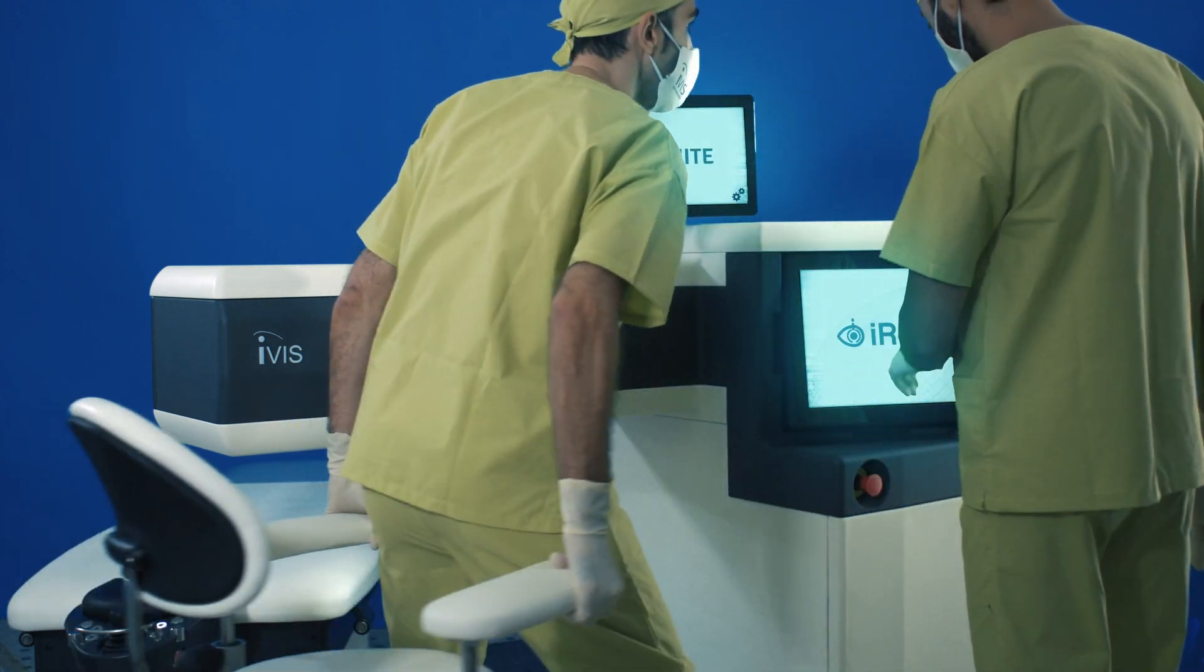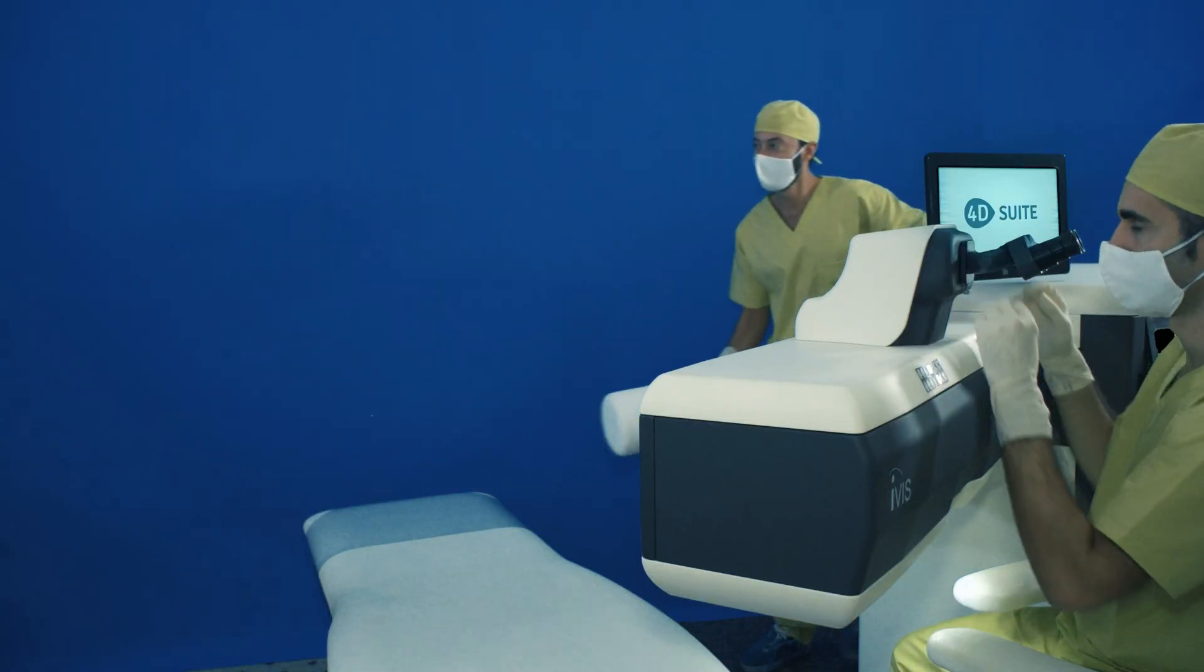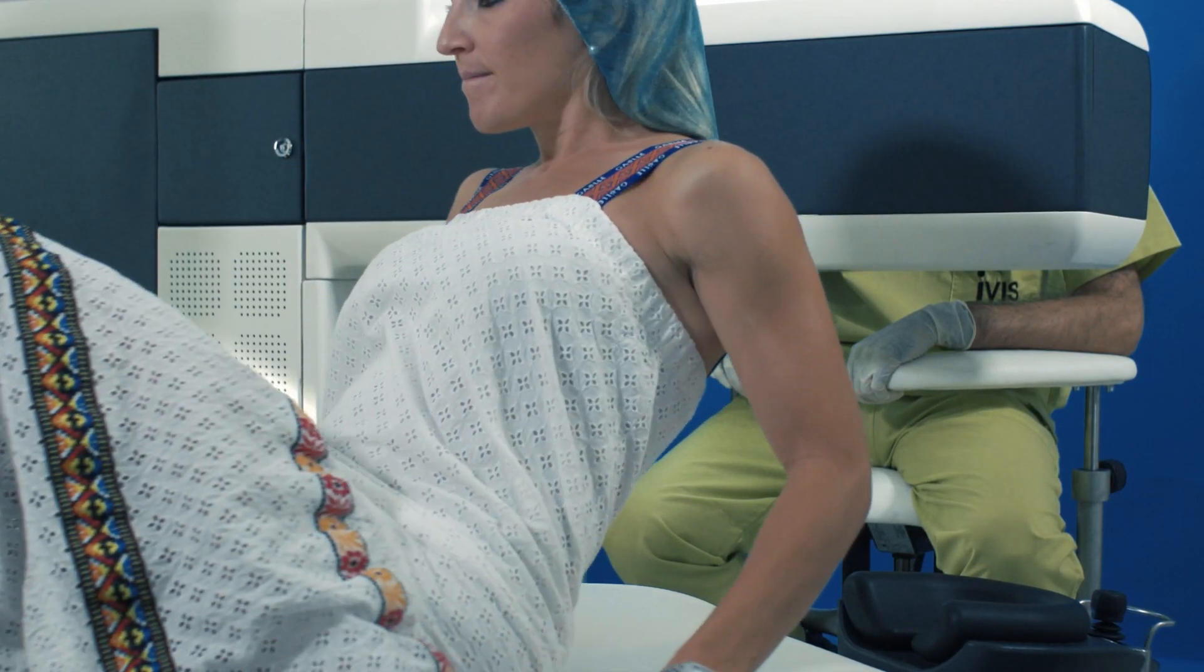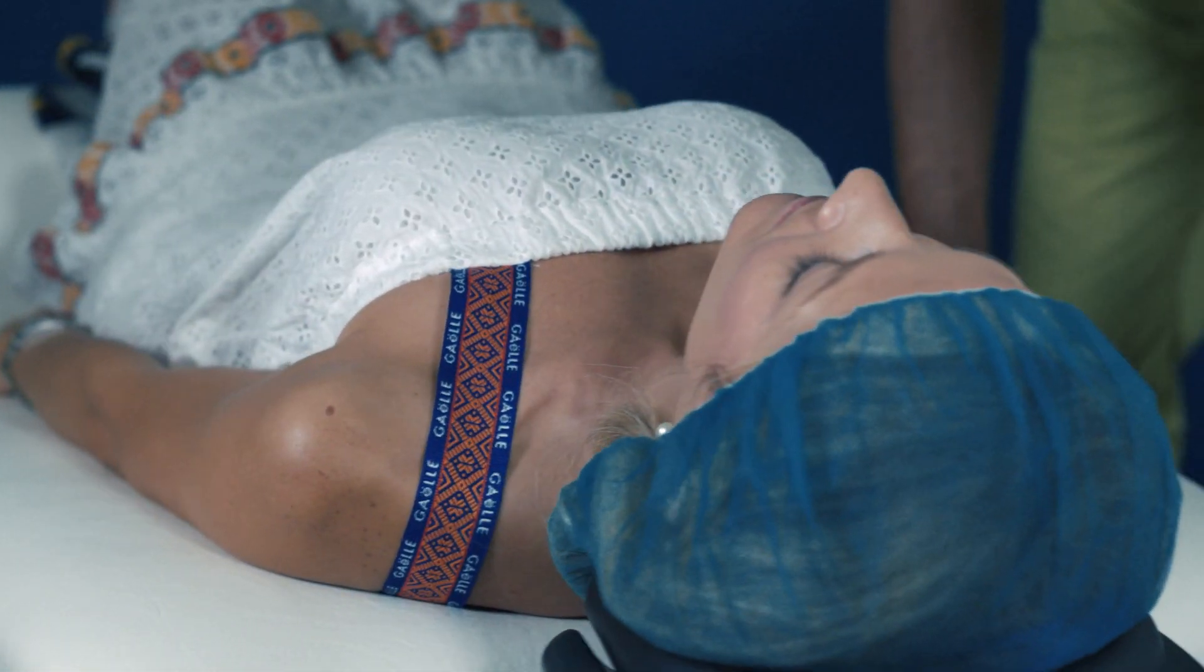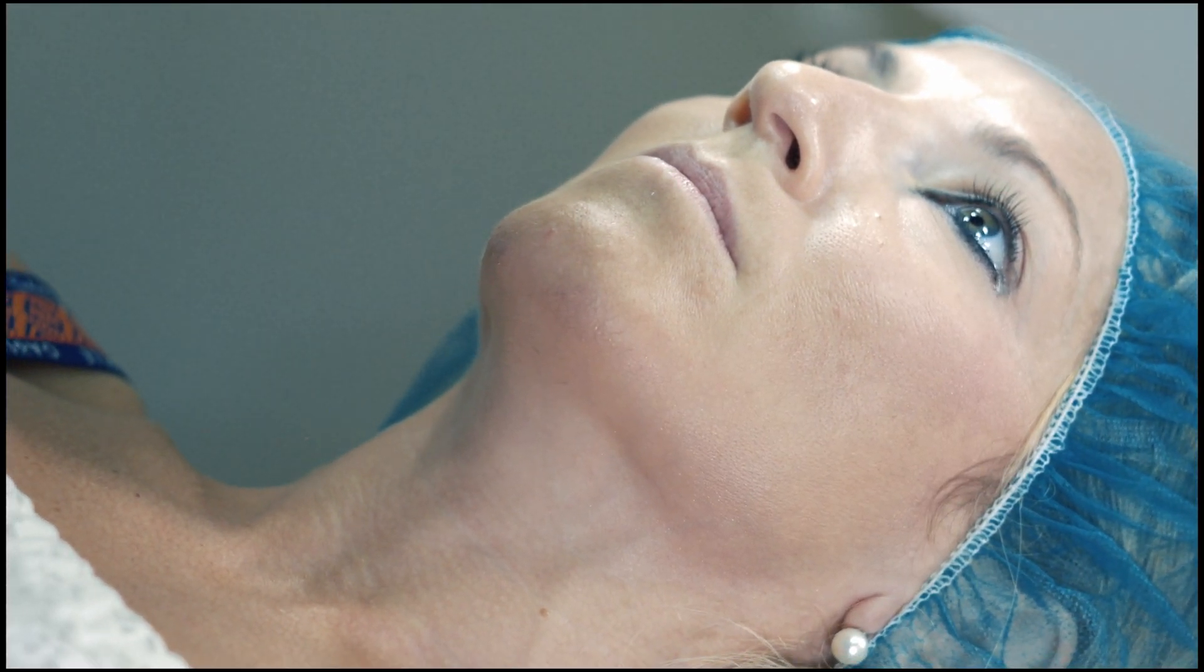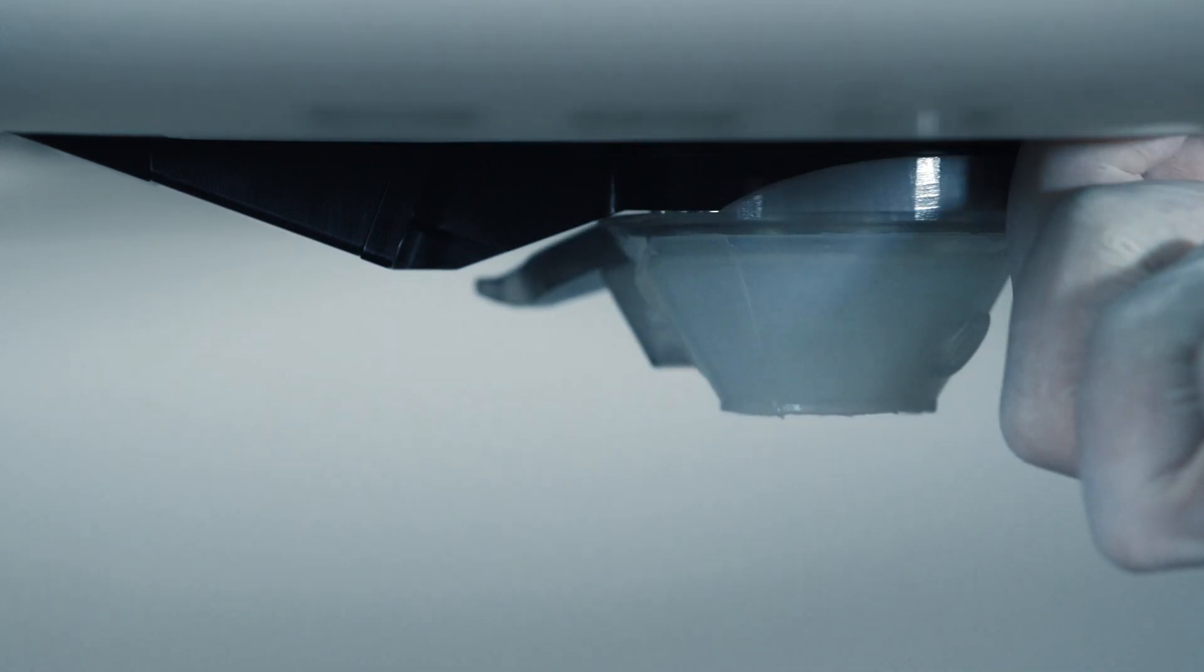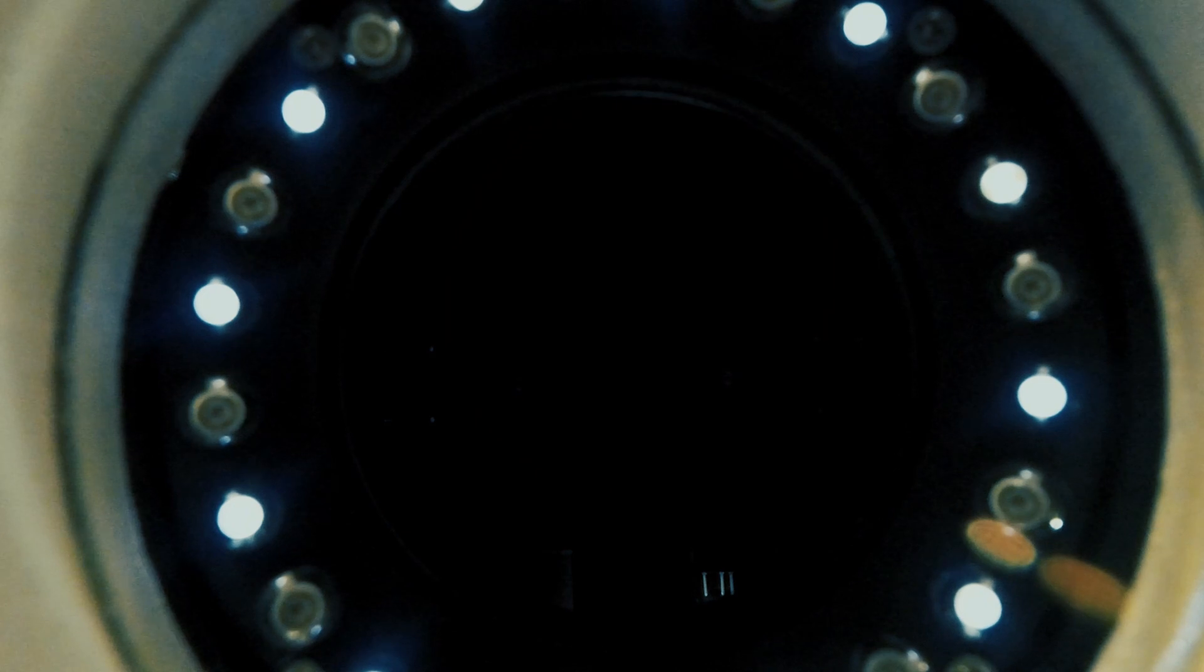IRIS 2 uniquely empowers a fully automated real-time controlled surgical procedure to grant performance standardization and avoid intraoperative risks. To grant full registration of the six degrees of freedom according to the data imported by Preciso 2, IRIS 2 implements a dynamic fixation continuously grabbing the patient's attention.